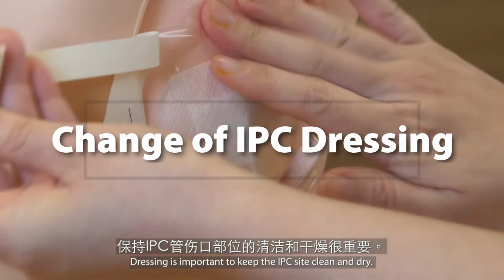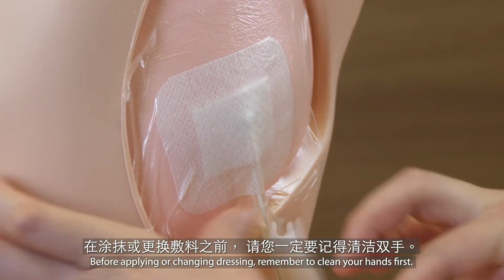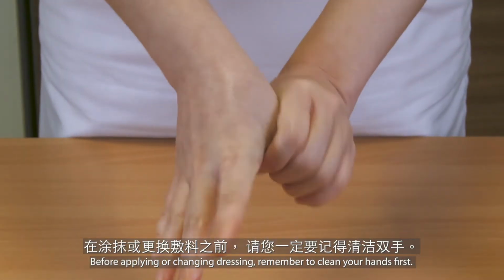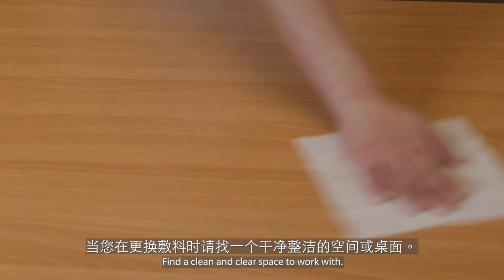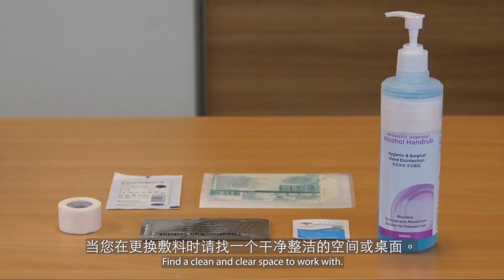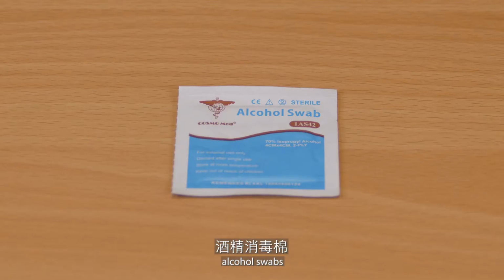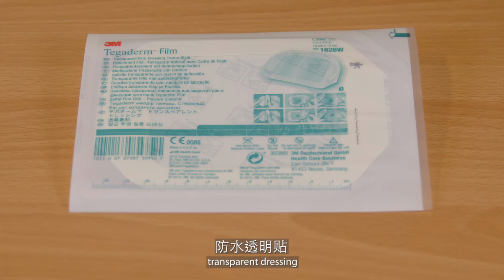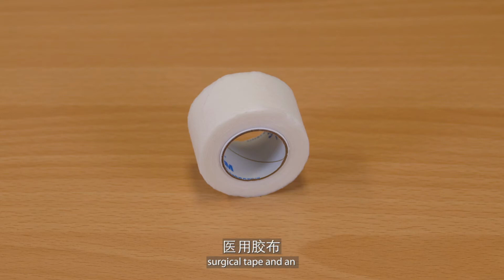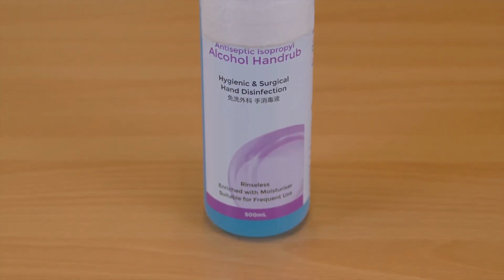Dressing is important to keep the IPC site clean and dry. Before applying or changing dressing, remember to clean your hands first. Find a clean and clear space to work with. You will need disinfectant swab sticks, alcohol swabs, island dressing, transparent dressing, surgical tape, and an alcohol-based hand sanitizer.